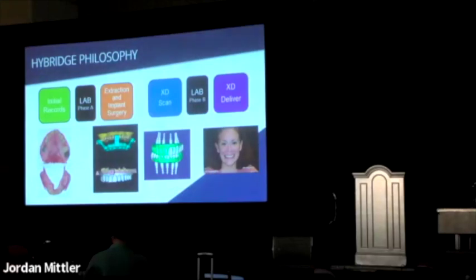These days, the simple way is a fully digital workflow. It's a digital start. It's a guided surgery with an immediate provisional. That immediate provisional, 3 weeks later, is removed. Sutures are removed. We do what we call a scan-alog digital scan. We capture tooth position of the provisional with the implant position. We articulate them with a really good centric relation record.